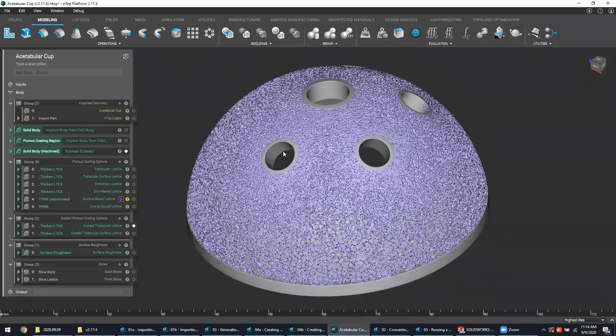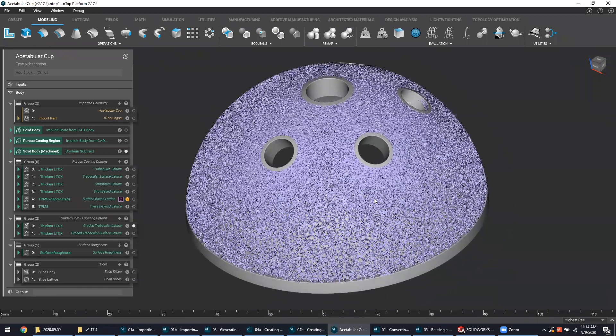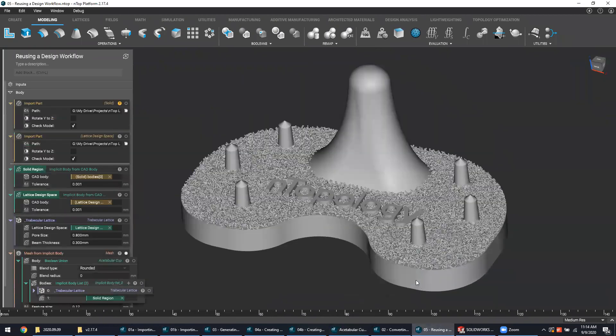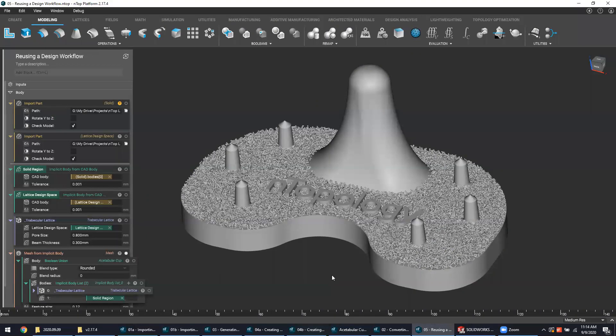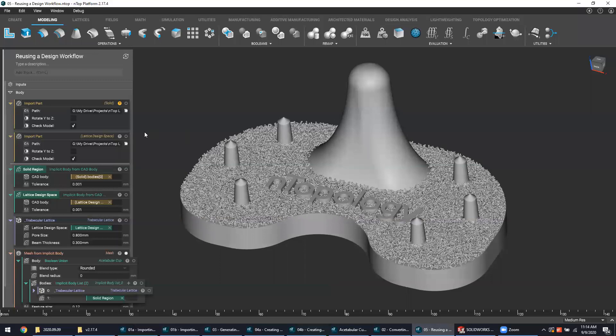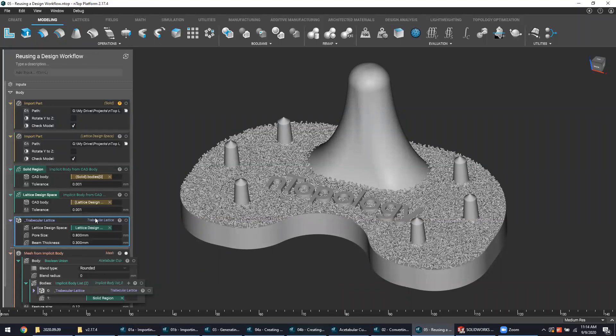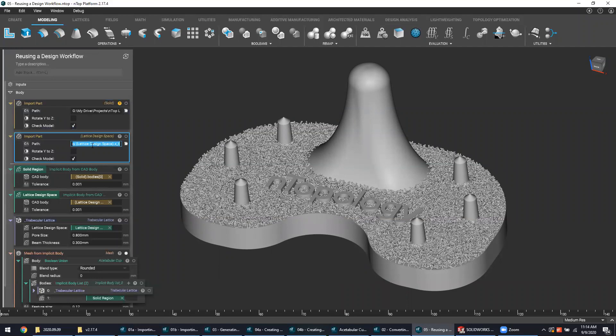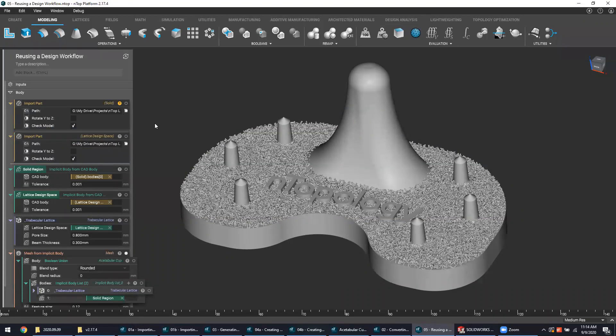The last point I'd like to leave you with is the idea of reusability. Even though the process that we stepped through was shown on an acetabular cup, the design process was put together in a way where it was geometry agnostic. This means that if we were to change the inputs from the bodies of an acetabular cup to the bodies of a tibial tray, we should expect to see a lattice with the same exact characteristics generated on this brand new part. We can see that even though the rest of the file looks exactly the same, the imported part now refers to components of a tibial tray. We are reusing the same workflow on different files.